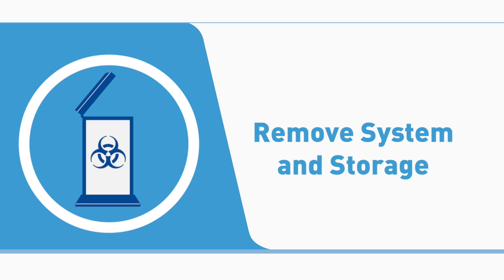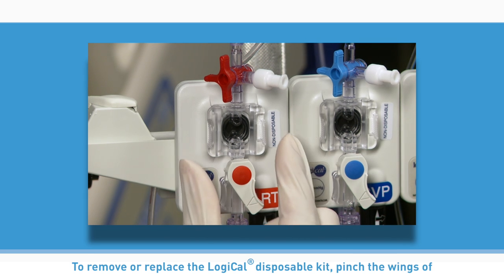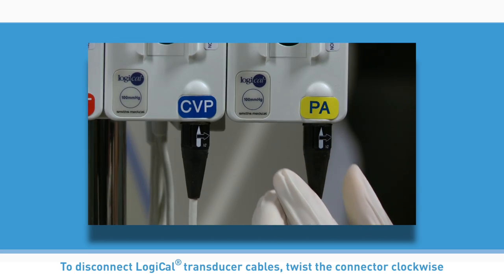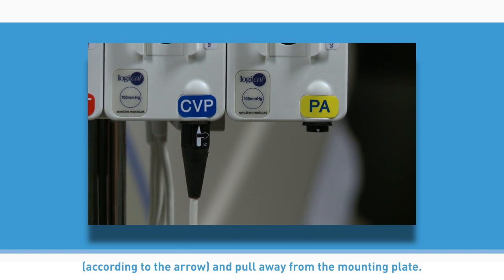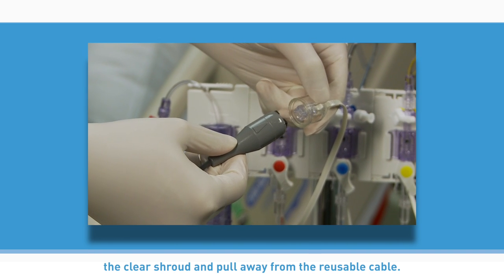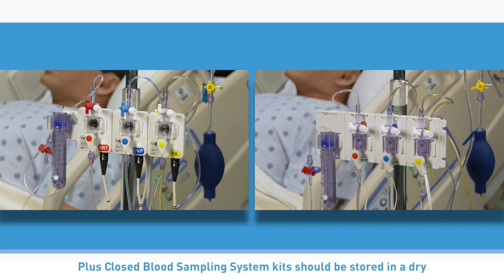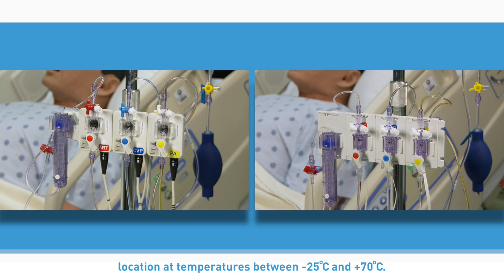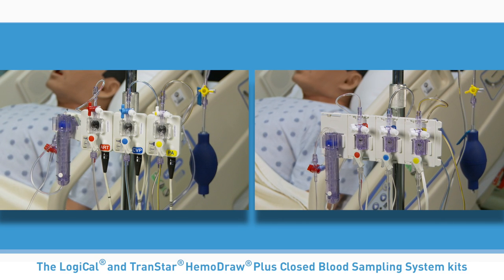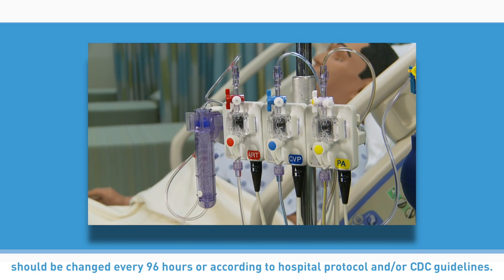Remove system and storage. To remove or replace the Logical disposable kit, pinch the wings of the disposable cartridge and remove it from the reusable plate. To disconnect Logical transducer cables, twist the connector clockwise according to the arrow and pull away from the mounting plate. To disconnect the Transtar cables, gently press down on the tab inside the clear shroud and pull away from the reusable cable. The Logical reusable pressure transducer and Logical and Transtar Hemodraw Plus Closed Blood Sampling System kits should be stored in a dry location at temperatures between -25°C and 70°C. Kits should be changed every 96 hours or according to hospital protocol and/or CDC guidelines.